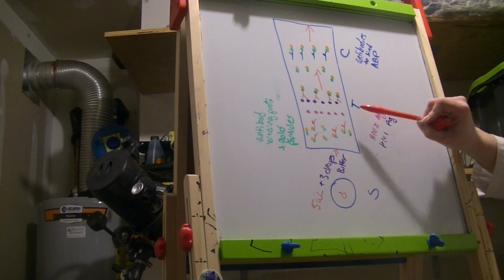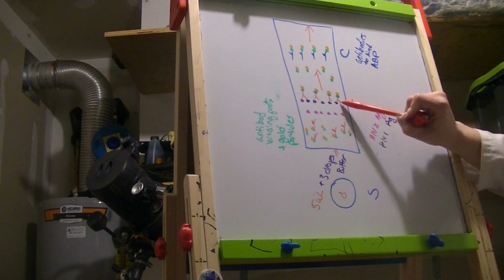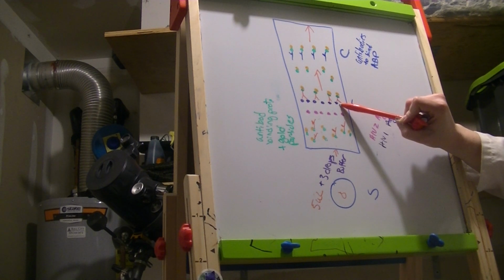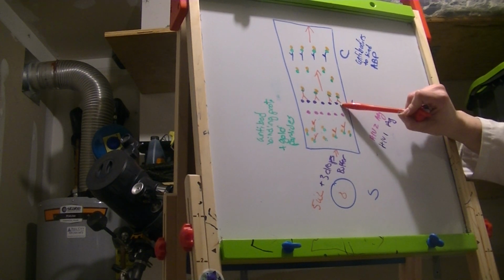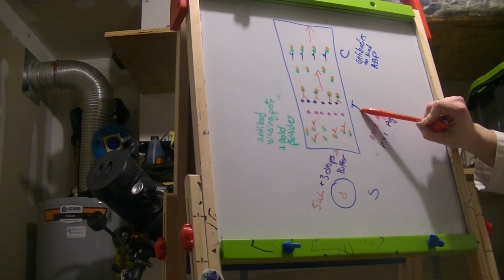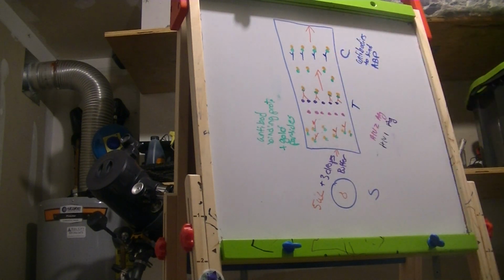In the test area, we have HIV-2 antigens and HIV-1 antigens. Since our patient has antibodies to HIV-1, they bind to the HIV-1 antigens in the test area, and enough of those gold particles get together that we see a line in that area.